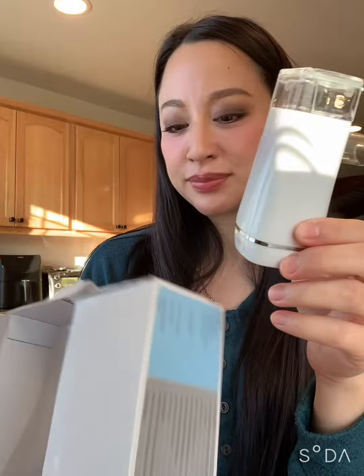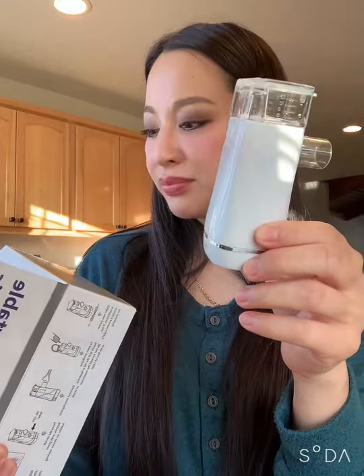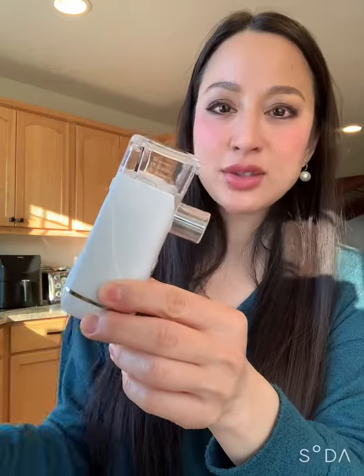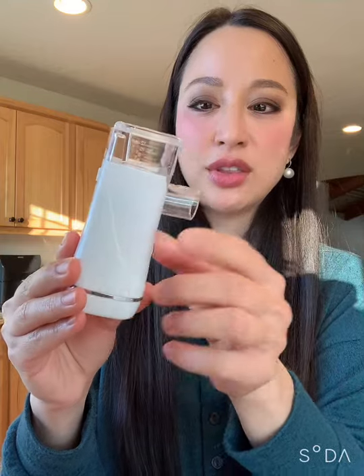The other thing I really want to say is when using these particular ones — I forget what brand this is — sometimes you need to tilt it this way so that the liquid comes into contact with the mesh a little bit more as you're running out.